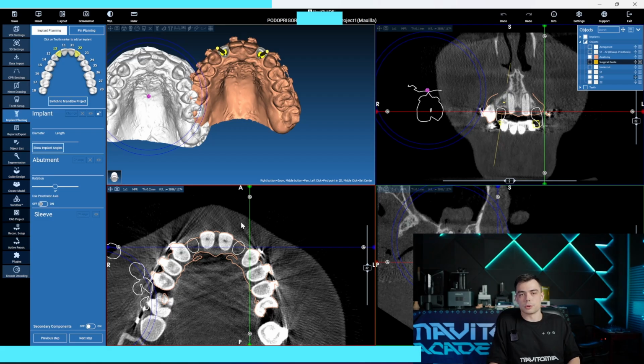I mean, surgical guide construction, surgical guide planning, and we are now more sure, so the probability of success in this case is much higher than the previous one, with previous data, where data was taken in different weeks even.